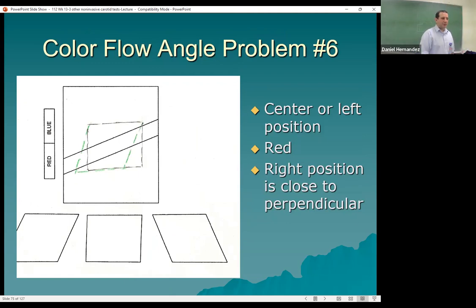That's why I like the IU-22, the Philips. When you actually Doppler to get your cursor lined up parallel to the vessel wall, it steers the box with it. Sometimes it's easier to go right to Doppler, or do the color and Doppler together. You angle to line up parallel to your vessel wall to get that angle correct, and it steers and optimizes your color box, giving you nice vessel filling. You can then take the Doppler function off and you should still have your color box at the same angle.